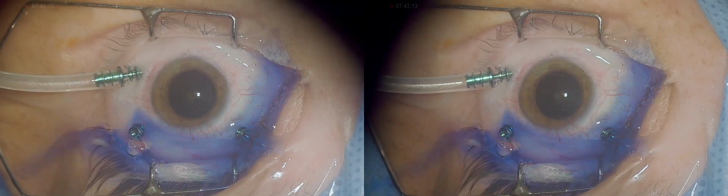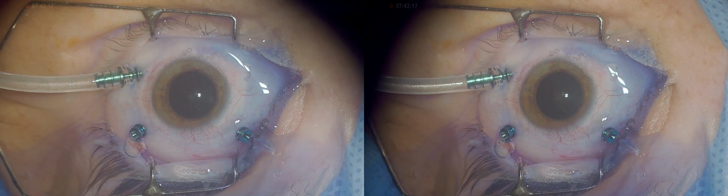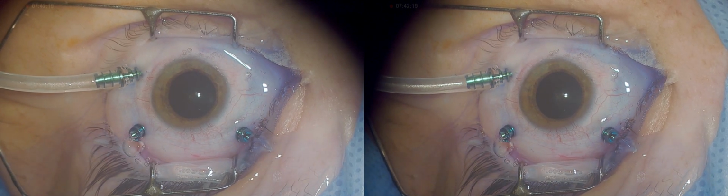For that purpose, brilliant blue is poured on the macular surface after this complete FAX and should not stay long, but only long enough to stain the ILM, so saline solution is allowed back into the eye within a minute or so. Staining was very good, and the ILM forceps 25 gauge is now back into action after the bluish membrane, lifting it gently and slowly so as not to cause any secondary tear on the way.